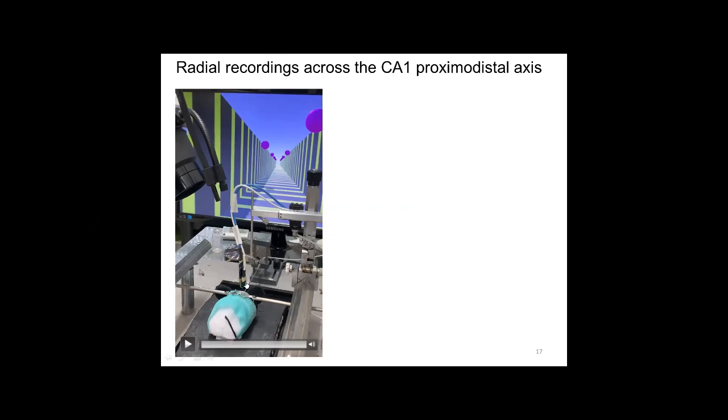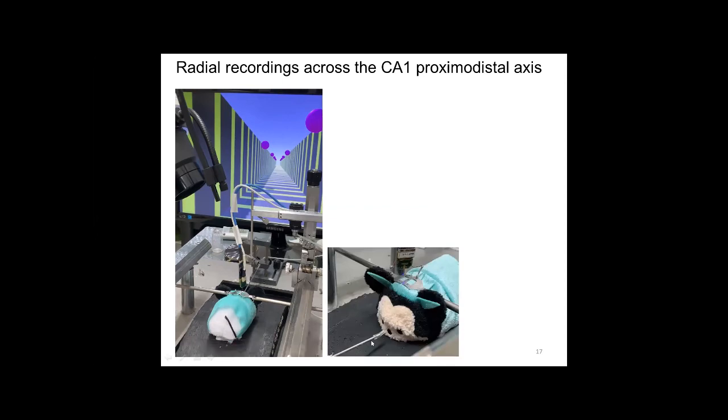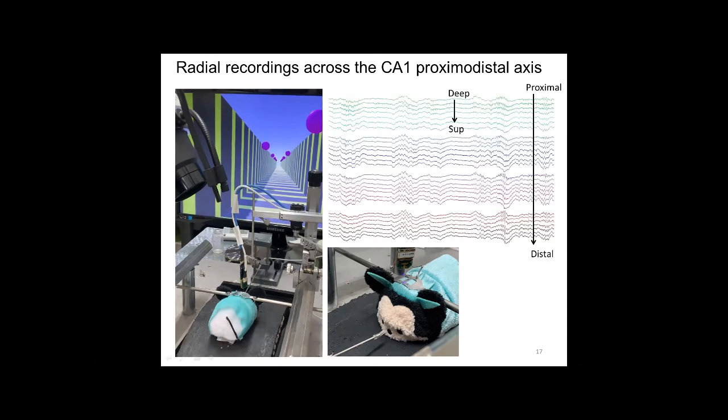Then you can couple that with the recording with the probe using, as I said, your micro manipulator. You can use reinforcement for the animal, or even couple that with sounds and design whatever combination of stimuli you want to have the spatial mapping that you want to address in the region of interest.